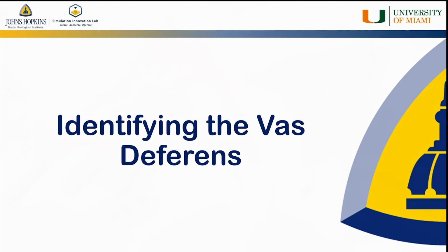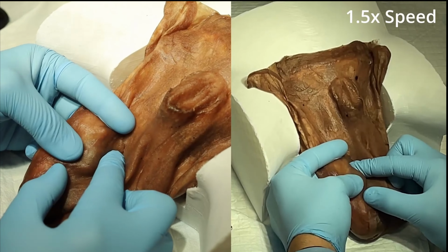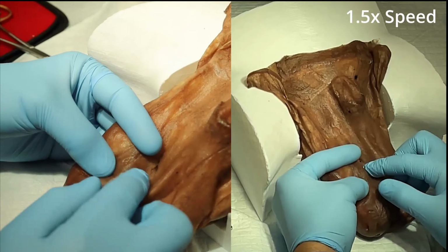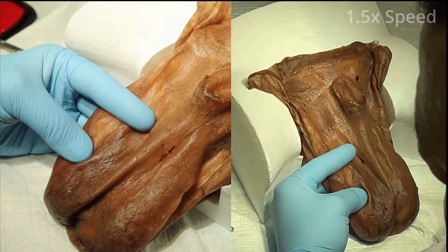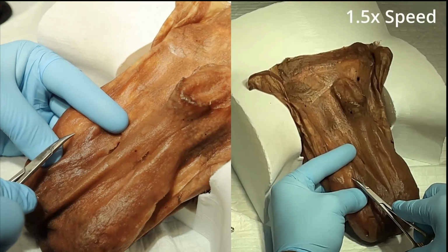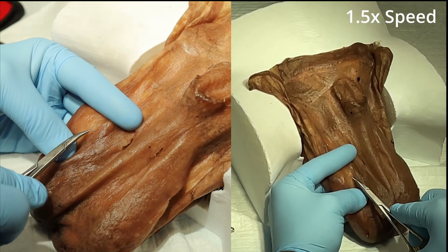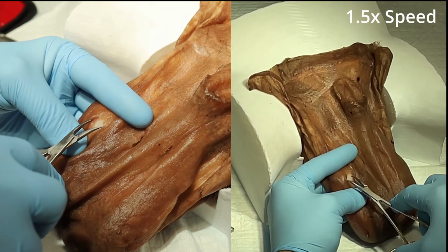Here, we see a surgeon is able to locate the vas deferens utilizing the three-fingered approach. The hydrogel scrotal skin was specifically formulated to allow the surgeons to feel the spermatic cord and the vas deferens between their fingers. All layers of the scrotum were recreated, including the skin, fascia, and dartos, thus allowing the surgeon to accurately dissect through each tissue layer as in live surgery.